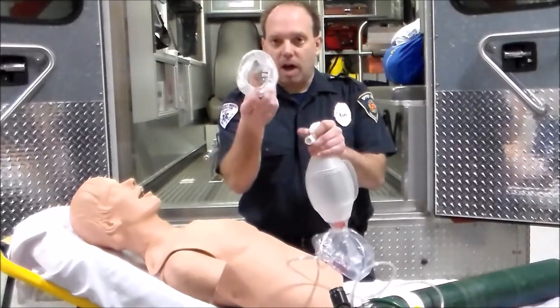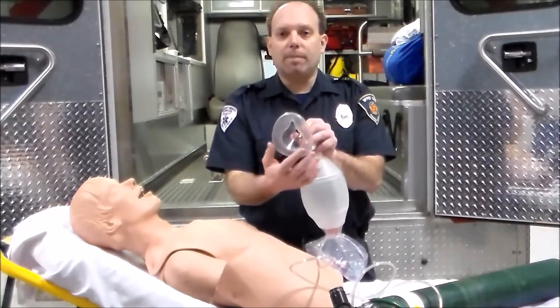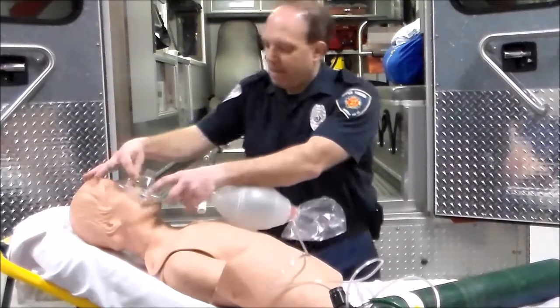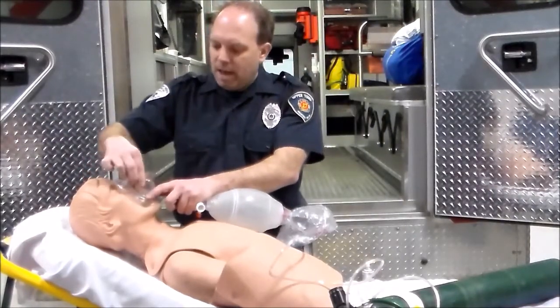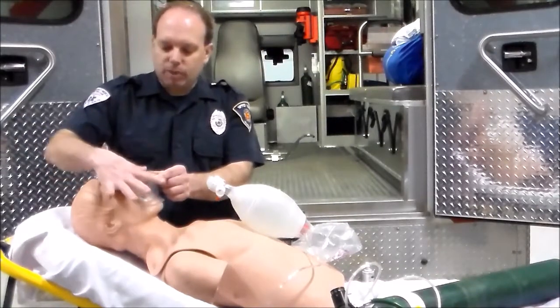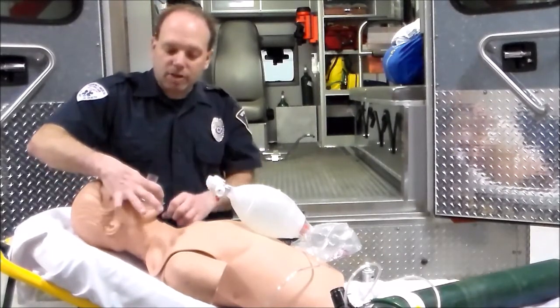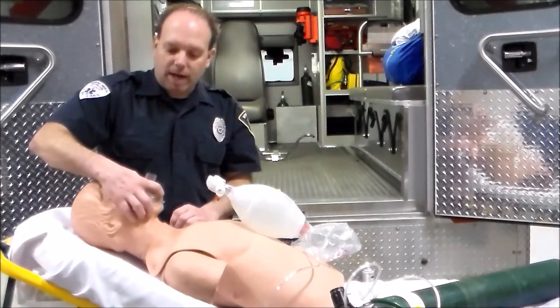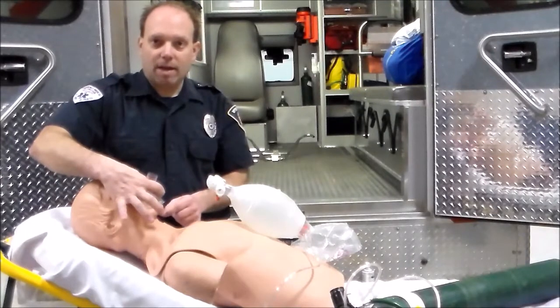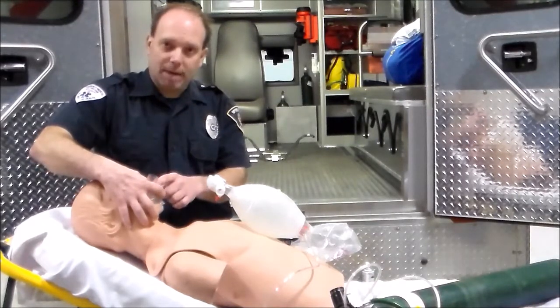The mask comes off and has a triangular shape. The soft section molds to the patient's face, with the triangular part going over the nose and mouth. The harder plastic section is where you apply the CE clamp technique. You form a C with your finger on top of the mask and bring your next three fingers down along the jawline — pulling up on the jaw while pushing down with the C. Alternatively, this is called the OK symbol technique. That's how you maintain a seal on the mask.